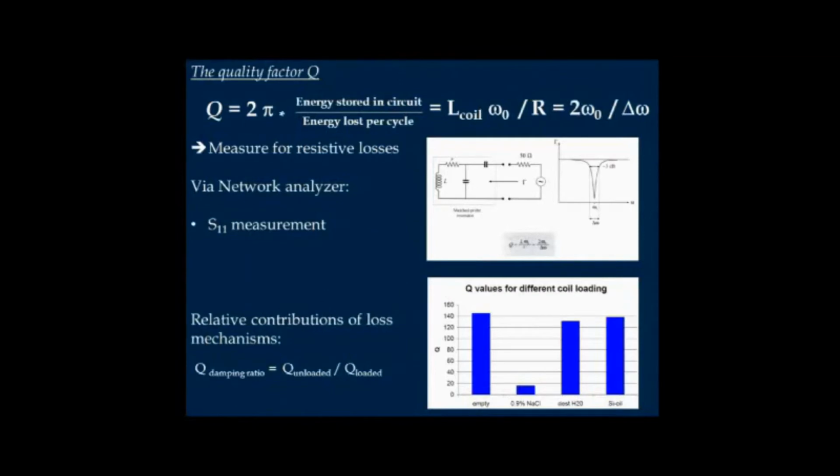Silicon oil should in that case be more or less equal. So if you have a look at those values for different loadings, then you can really tell the coil, okay, the coil does see a little electric field in this example and is quite sensitive to loading where magnetic interactions take place.